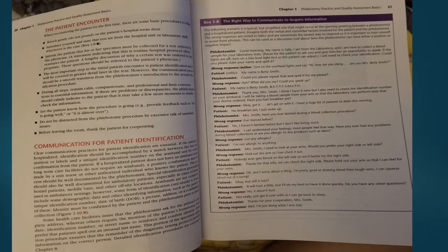See Figure 1.10. Some healthcare facilities insist that phlebotomists ask for the patient's complete address, whereas others require the mention of the patient's hometown, birth date, identification number, or a street name to reinforce and confirm the identity. Some prefer the patient spell out an unusual last name. This portion of the specimen collection procedure ensures that the remainder of the diagnostic testing protocol provides information on the correct person. Detailed identification procedures are covered in Chapter 8.